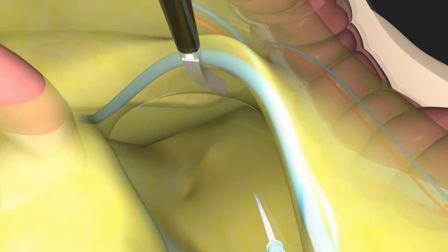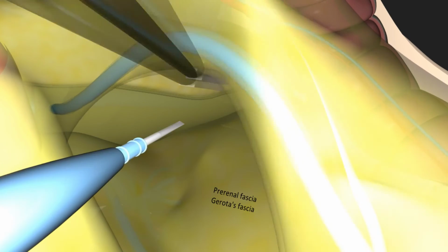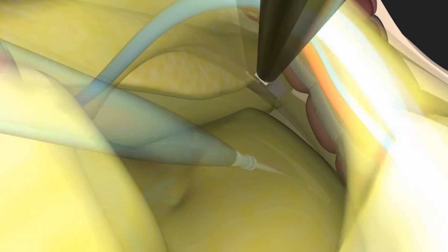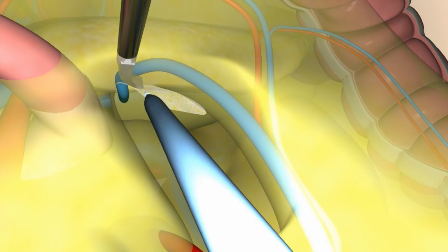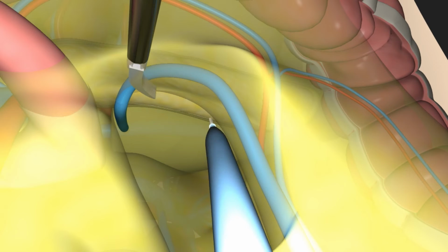Then the inferior mesenteric vein is identified to the left of the inferior mesenteric artery or, in case of difficulty, higher, just left of the ligament of Treitz junction. The vein is divided below the inferior border of the pancreas or above the left colic vein.